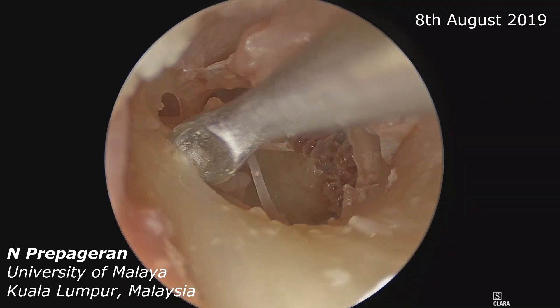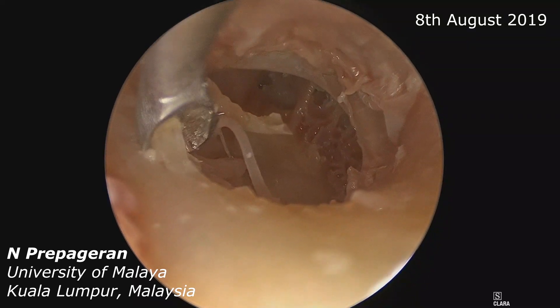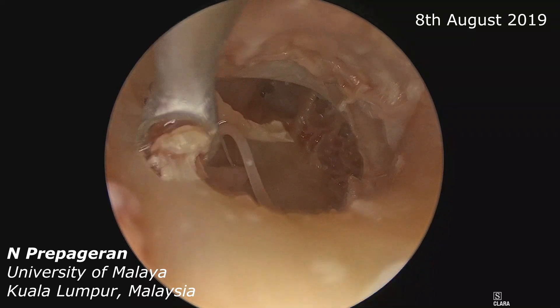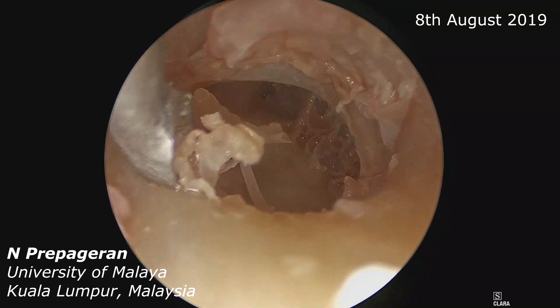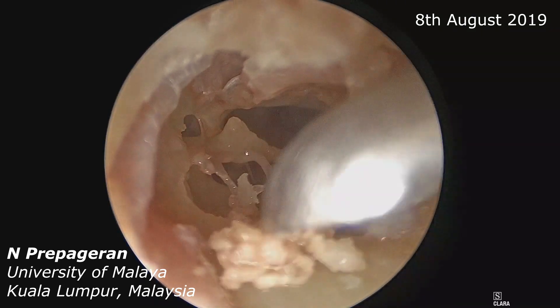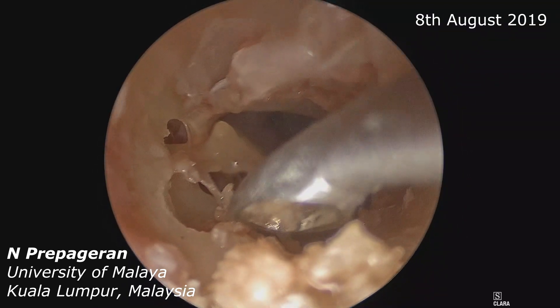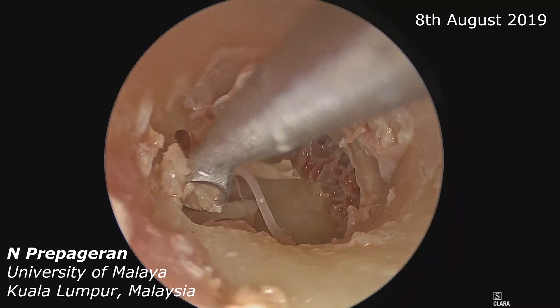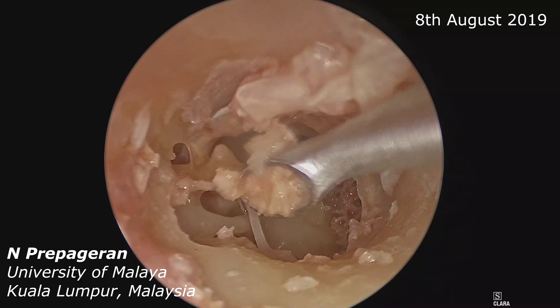Now if you want to do an atticotomy, we don't usually use a drill — we just use a curette. Make sure your curette goes in the right direction. If you are right-handed, this is the movement you need to do. Make sure you don't go in too deep, because if you go in too deep you will accidentally injure the ossicles.